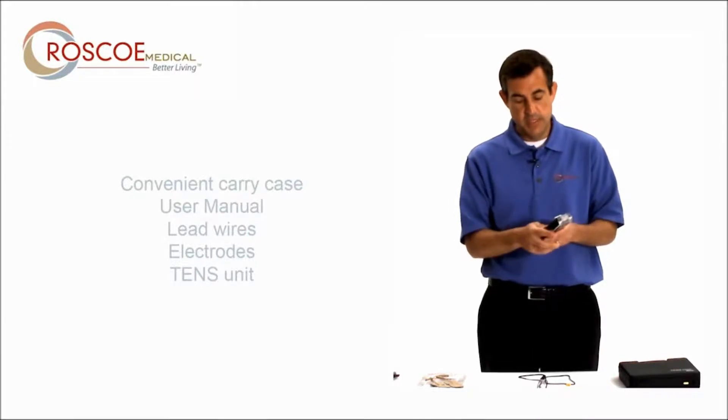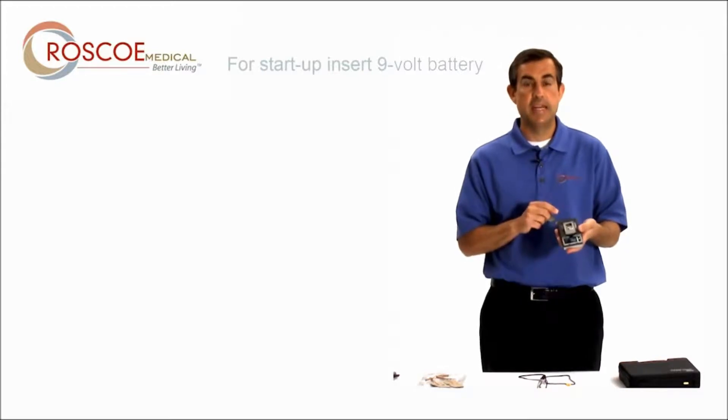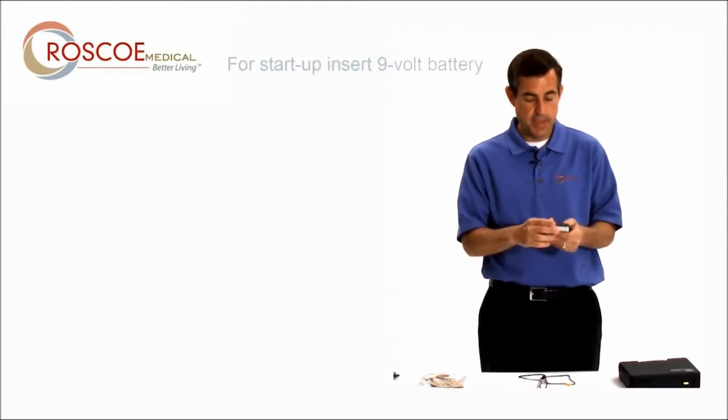The first thing you do with the unit is in back, you want to make sure you put your battery in. It's a 9-volt battery, and put the cap back on.